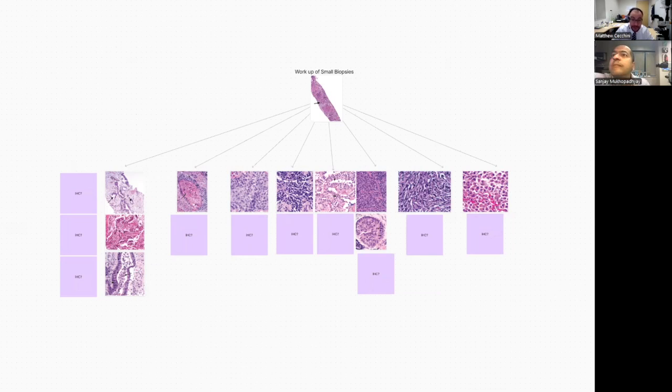We're going to talk today about small biopsies, the approach to small lung core biopsies, and immunohistochemistry for them. Maybe before we get into it, Sanjay, do you want to tell people why it's important to think before you just order a bunch of stains on a small biopsy when you're working up lung cancer?